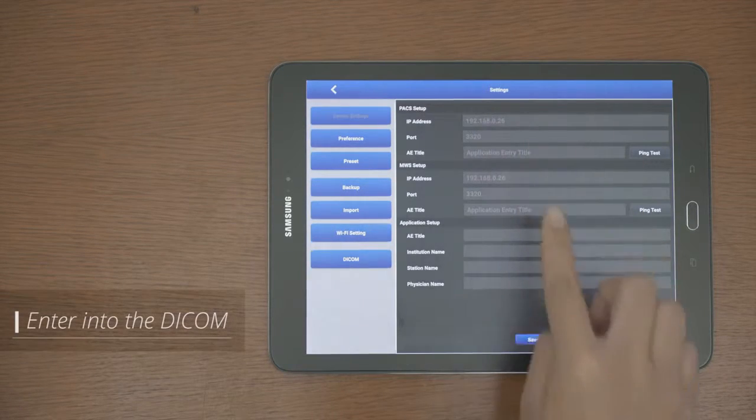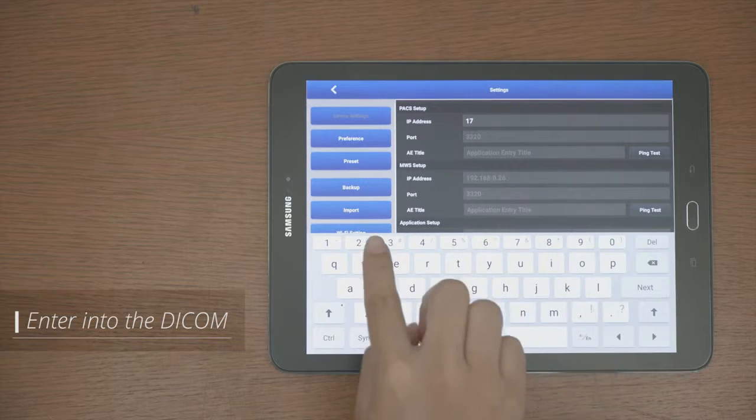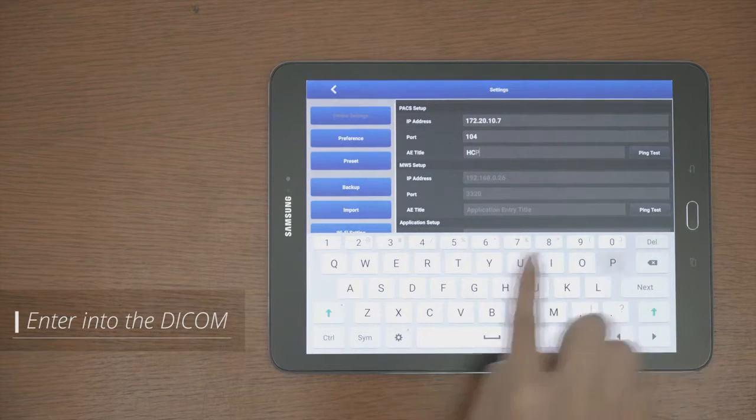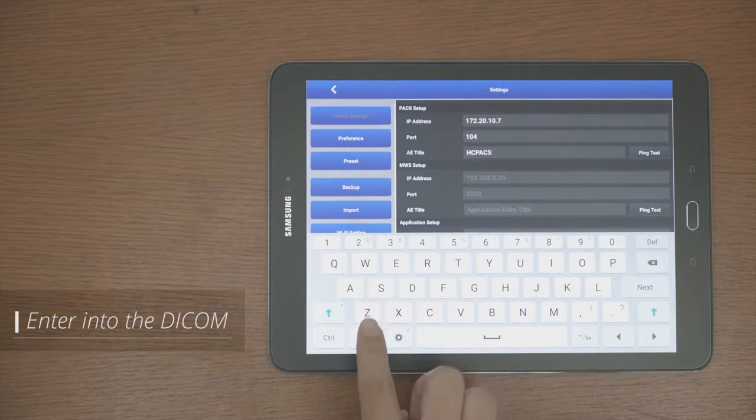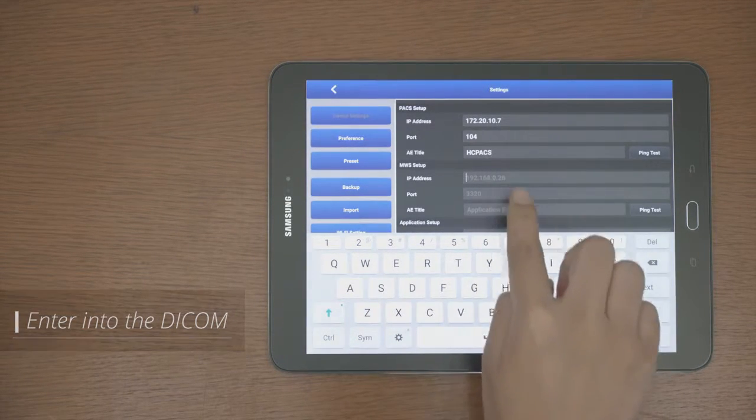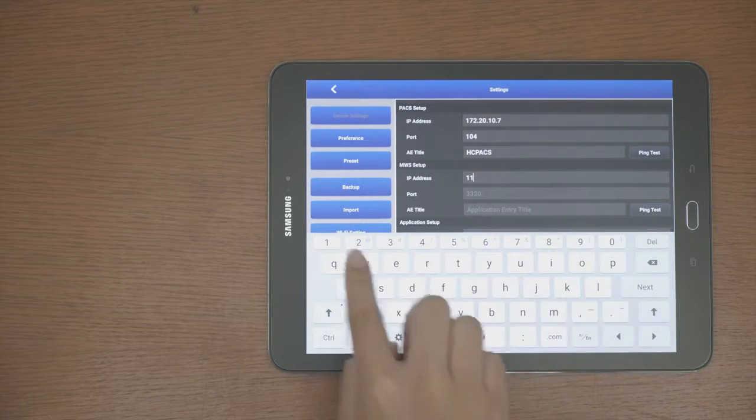Finally, to connect the worklist with PACS, enter into the DICOM screen, fill in the PACS Setup, MWS Setup, and Application Setup Items.